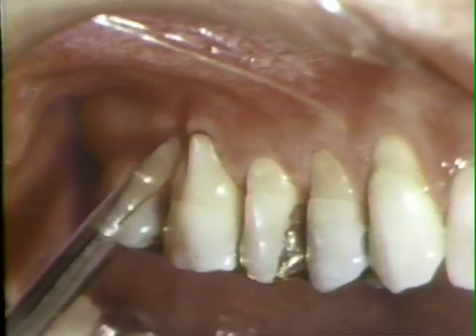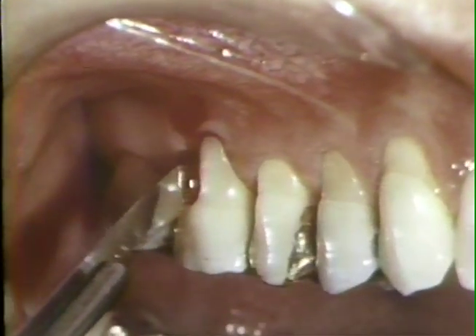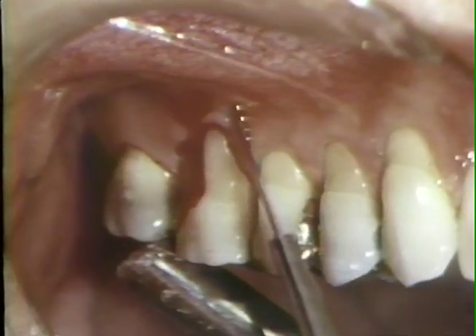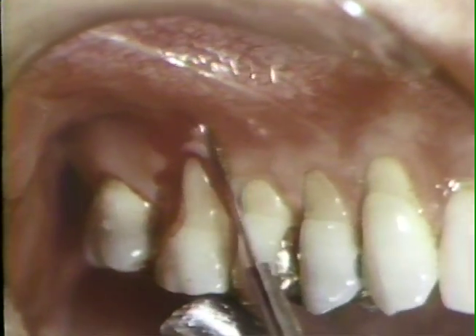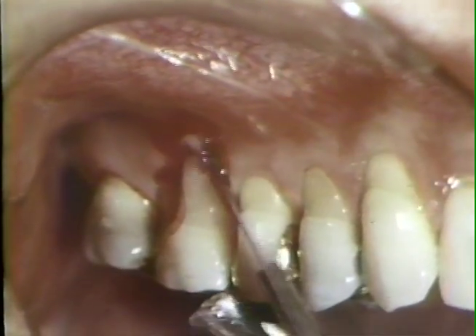After infiltration anesthesia has been obtained, a vertical incision is made on each side of the involved root. These are joined, and the soft tissue bordering the pocket is removed.